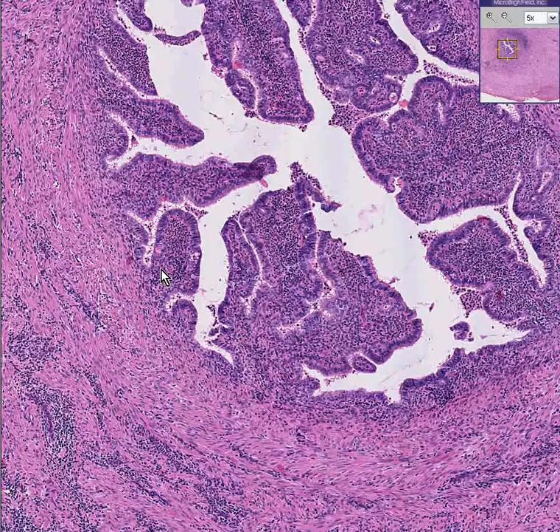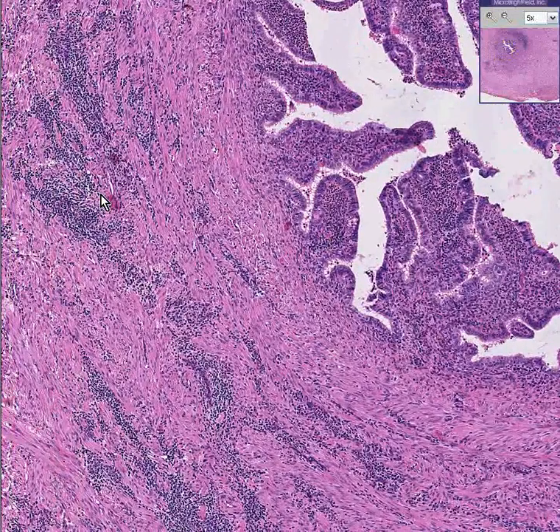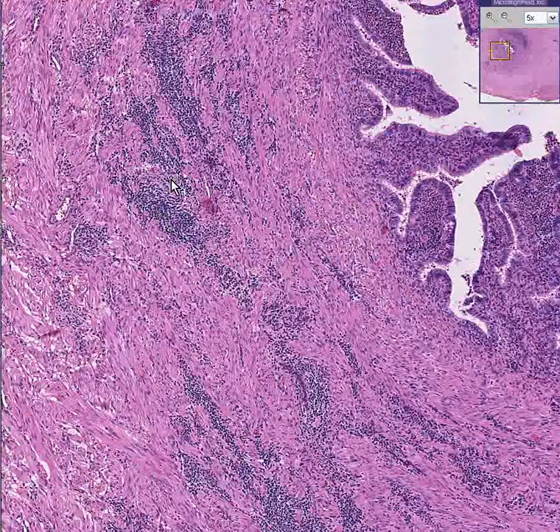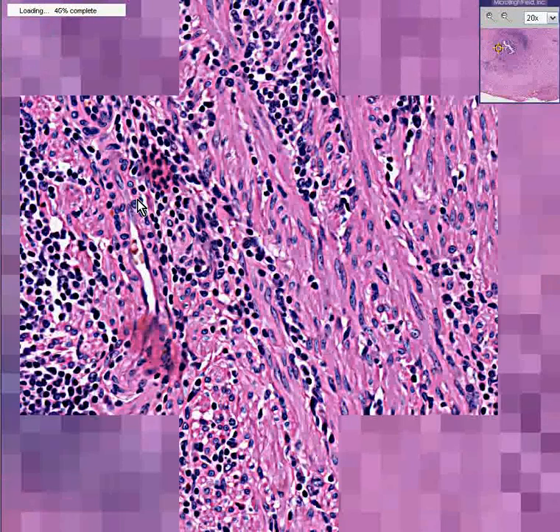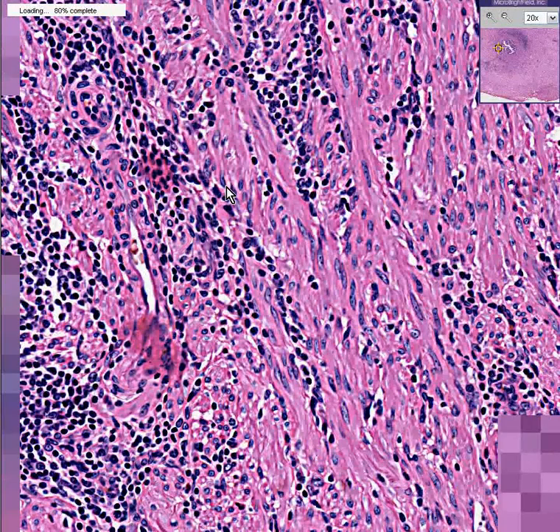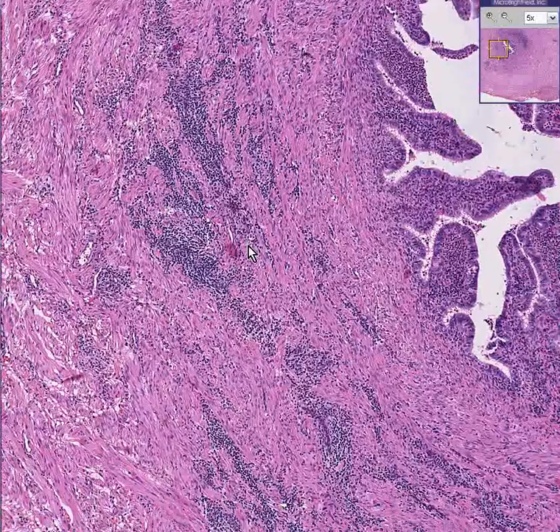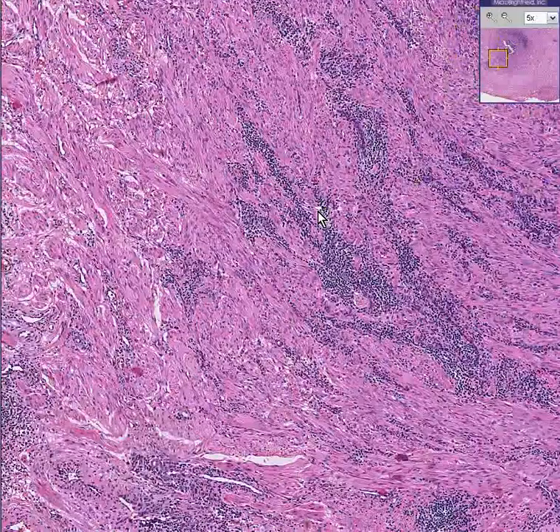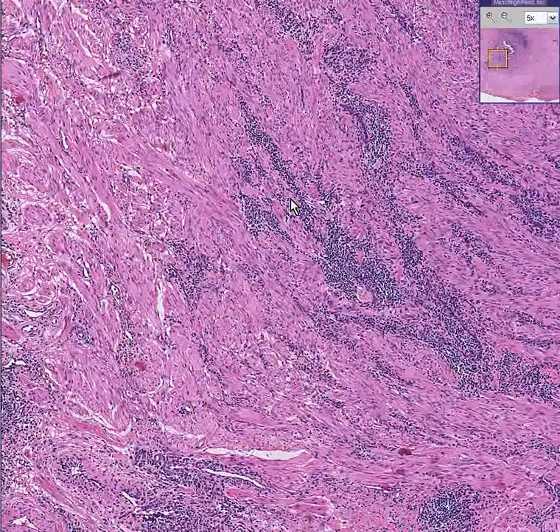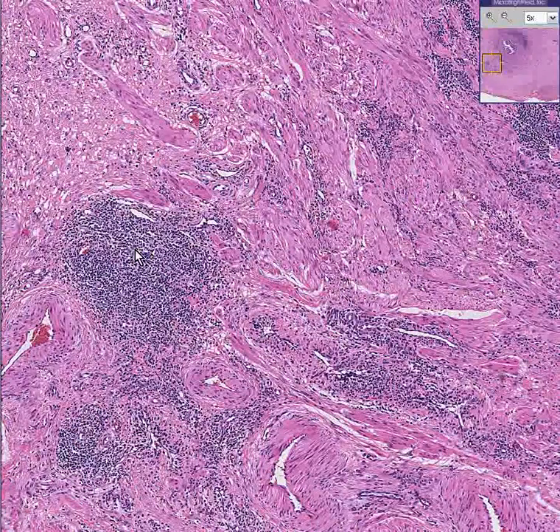Notice that within the smooth muscle we see extensive infiltrates of lymphocytes — nice-looking round lymphocytes all over the place, some diffusely distributed and some looking like perhaps primary follicles, like over here.